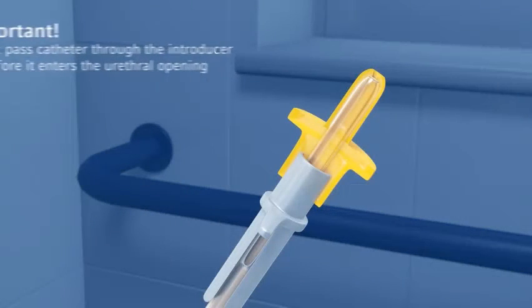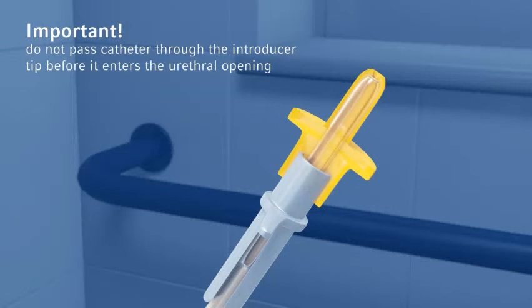The introducer tip is one of the main features of the MMG close system for helping to reduce the risk of urinary tract infection. The introducer tip protects the catheter, allowing it to bypass the first 1.5 centimeters inside the urethra where the majority of the bacteria reside. Therefore, it is very important that the introducer tip is inserted into the urethra the full 1.5 centimeters before you start advancing the catheter.